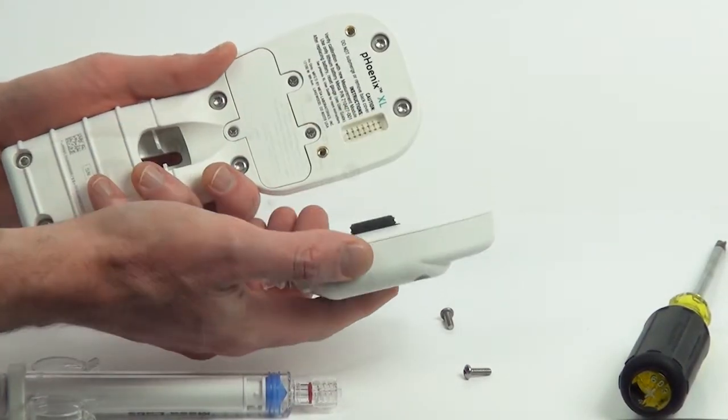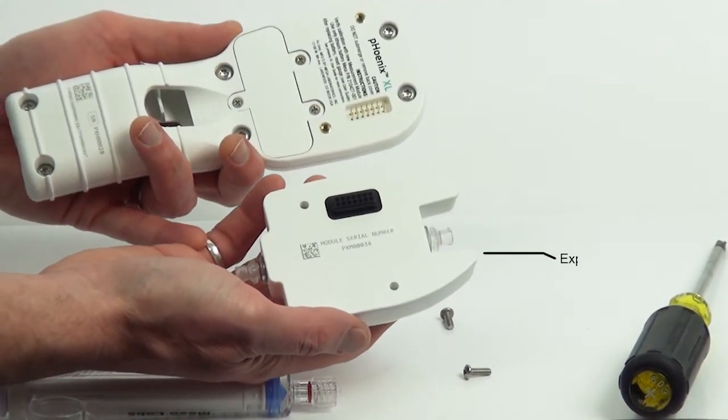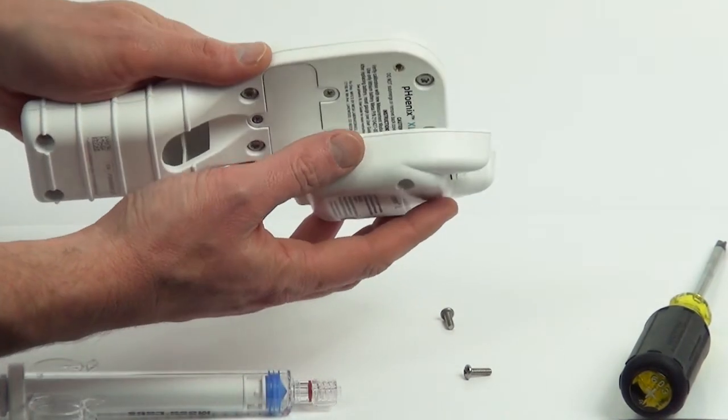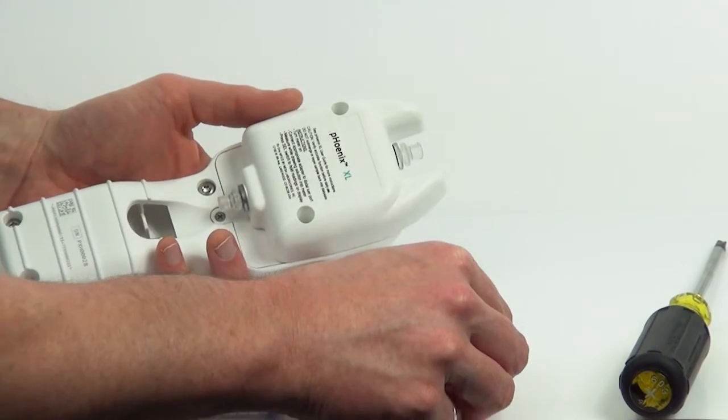Measurement modules have an expiry of one year, after which they can simply be discarded and replaced with a new unit. This eliminates being without your meter, as you will no longer need to send it back to the manufacturer for maintenance.